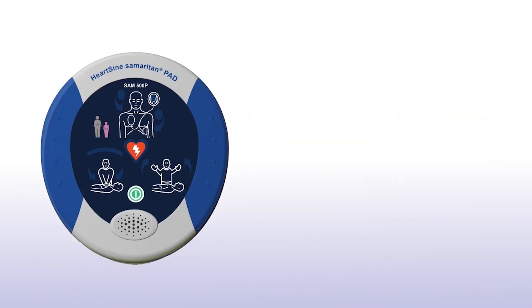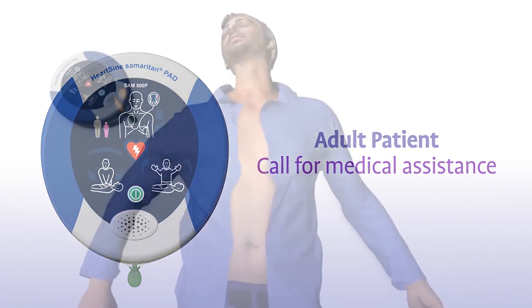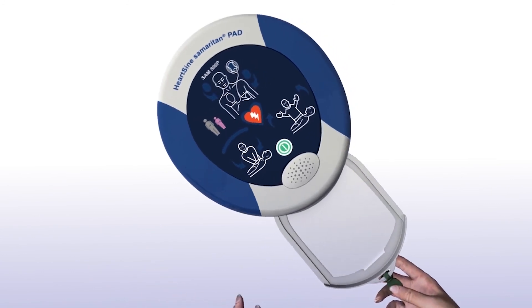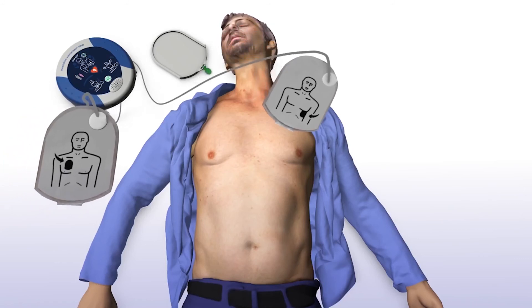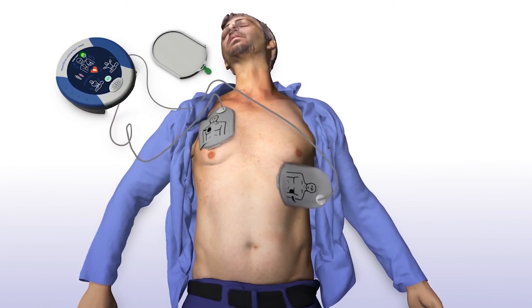If a pink paediatric pack is not available, you may use the grey adult pad pack instead. Remove clothing from the patient's chest to expose bare skin. Pull the green tab to remove pads, then peel pads from the liner. Apply pads to the patient's bare chest as shown in the picture and press pads firmly to the patient's bare skin.